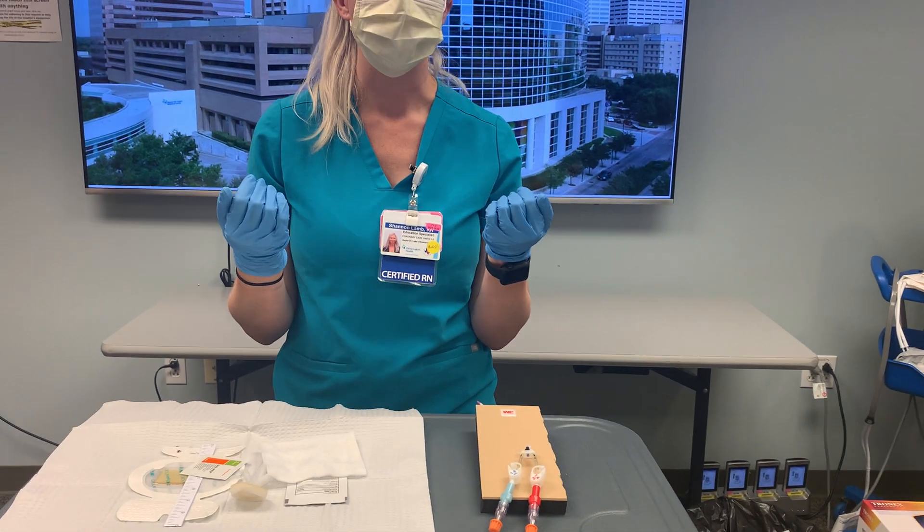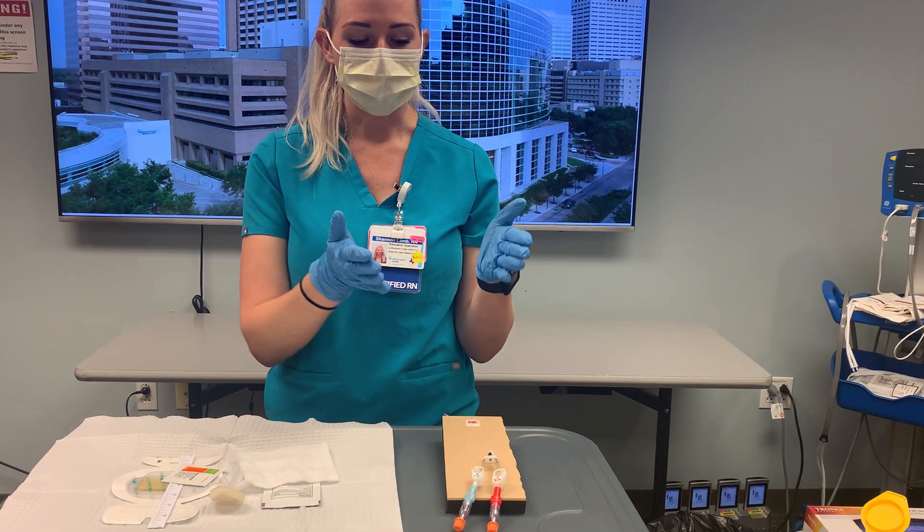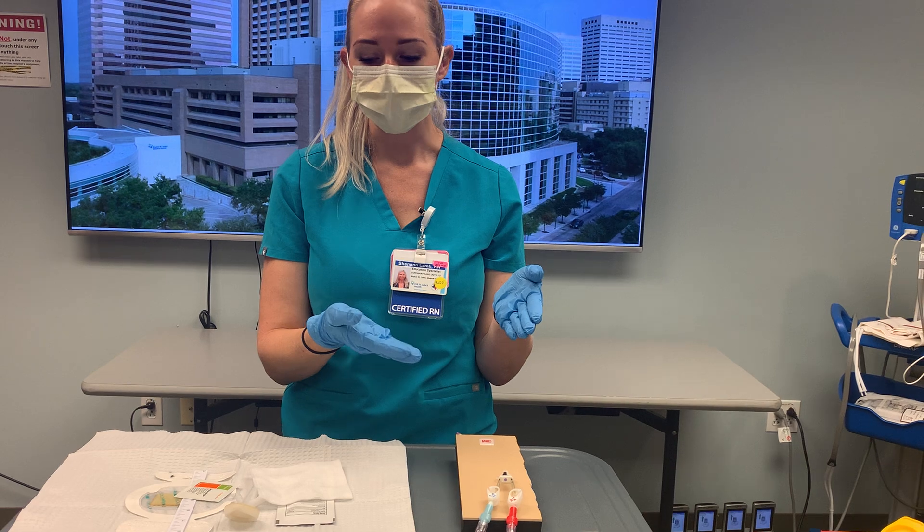We'll walk through the steps of performing a dressing change with our new products now. As I said before, we've already prepped the patient and we've removed the old dressing using a clean technique.